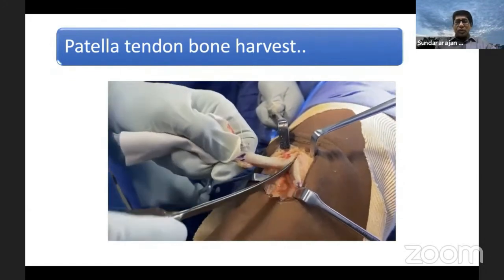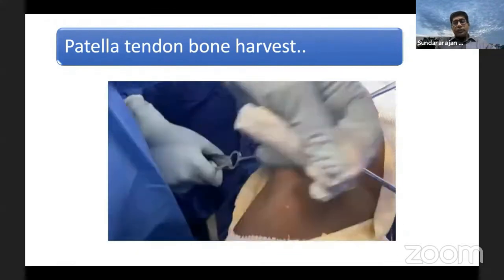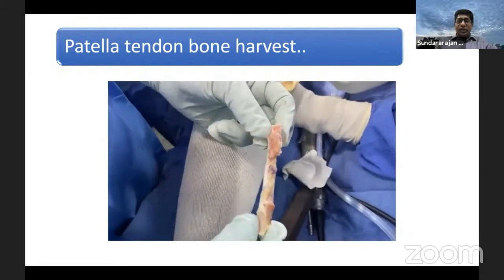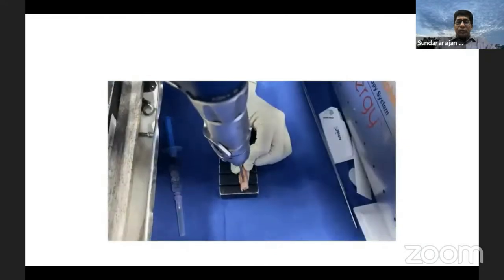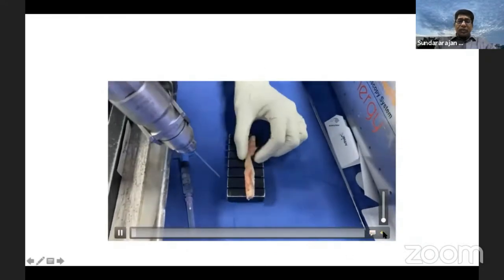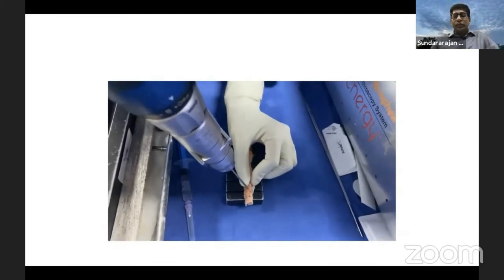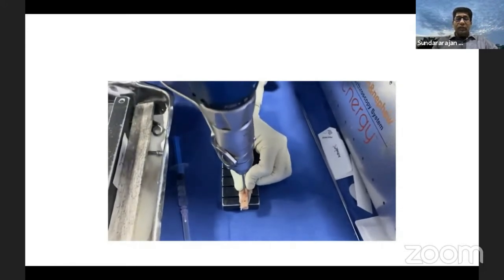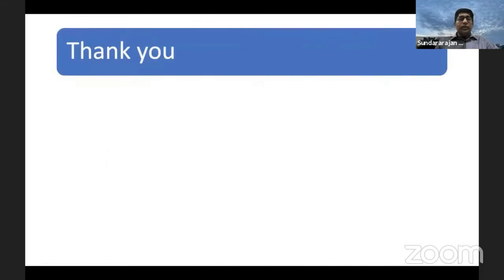Make all-sided cuts — both medial, lateral, distal, and underneath — keeping it around 9mm, so that you don't fracture it with the osteotome. The osteotome is only to deliver and provide the final detachment of your patellar tendon graft from the parent patella. Then use a small curved osteotome for adjusted delivery. This is your PTB graft harvest — then you nibble it to make the size of 9 to 10mm, then make drill holes both proximally and distally with at least two holes keeping a distance of at least 5 to 10mm, so that you can use fiber wire or SS wire for your graft passage. That is the patellar tendon graft. Thank you very much.